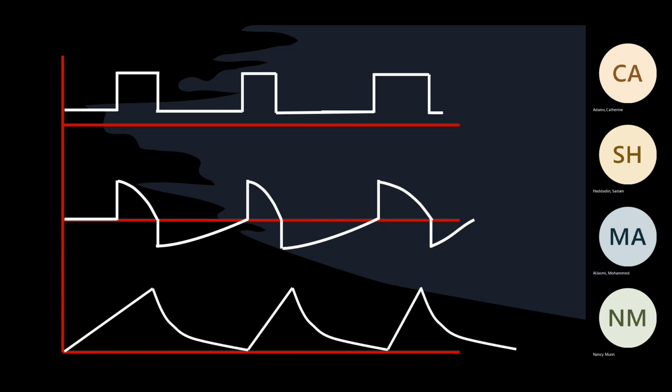So, which is my mistake in doing this slide, if this one was triggered, we know it's triggered by the patient, and we don't know if it's cycled by the machine or by the patient, is that right? And this one was triggered by the patient, and obviously it's not the same timing. So who's controlling the cycling is the patient. Is that right? Because it's not exactly the same. But we said if the patient is controlling the cycling, but the machine is controlling the trigger, it's still a mandatory breath.